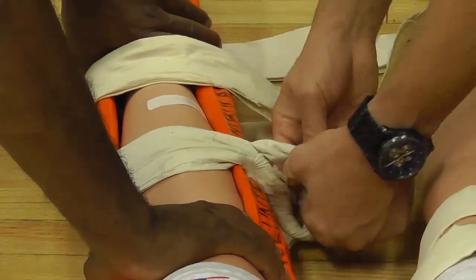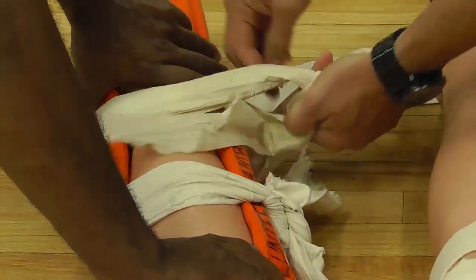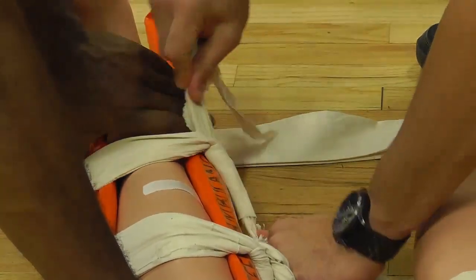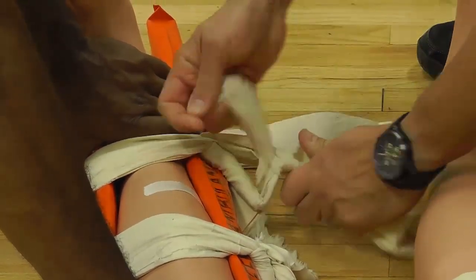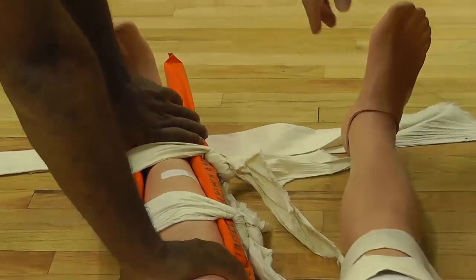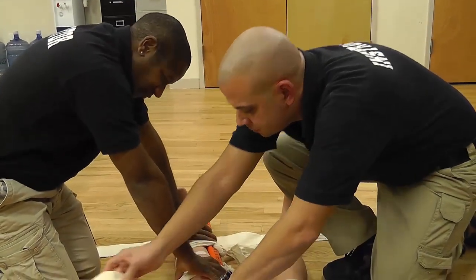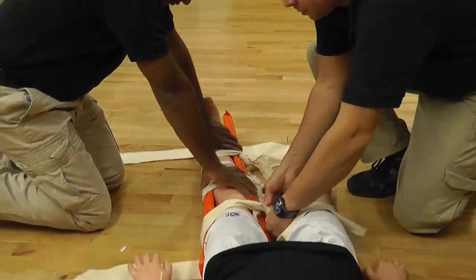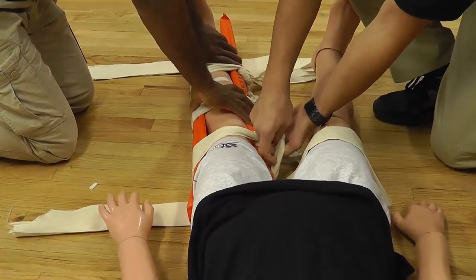I'm going to follow through with an overhand knot. Next, I'm going to tie the two cravats that are above the patient's knee using the same technique — starting with a surgeon's knot and finishing with an overhand knot.